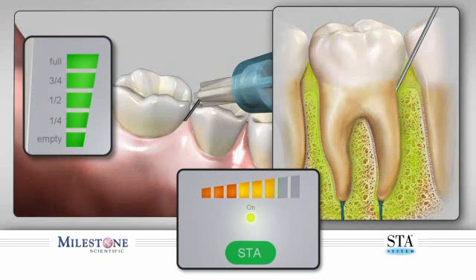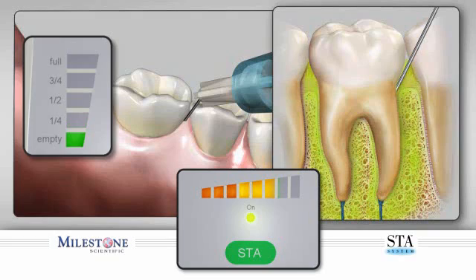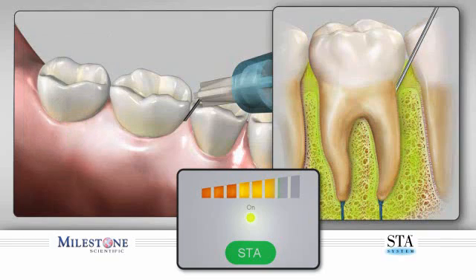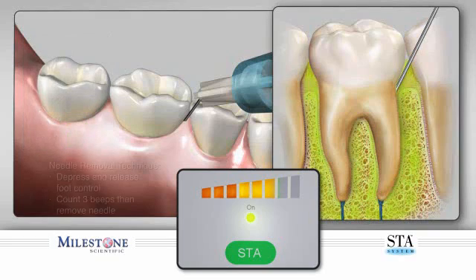To determine the amount of anesthetic solution dispensed, you can view the vertical green LED volume gauge in the upper left corner of the STA. As the green LED light dims, you will hear a corresponding louder tone at each quarter cartridge.